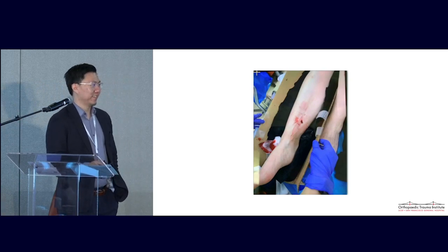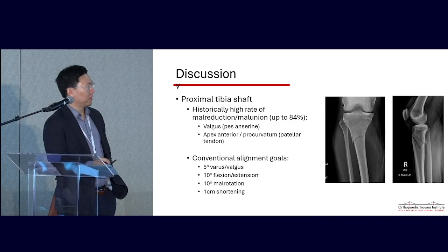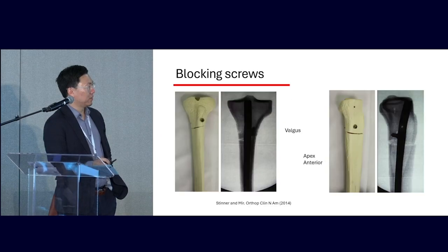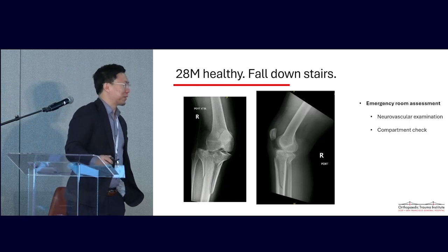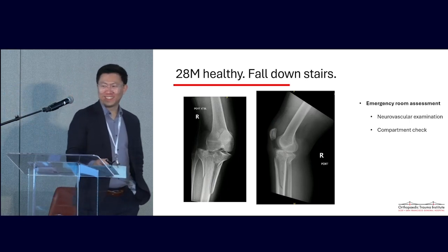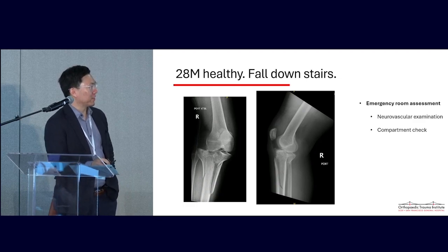All right, Mark, what else we got? Yeah, I have one more case here. As long as you don't put a plate on it. No plate for this one. That's definitely nailable. So this one, 28-year-old male, fell down some stairs.